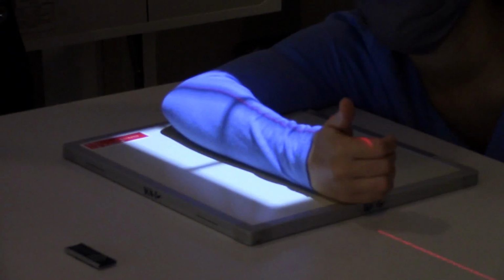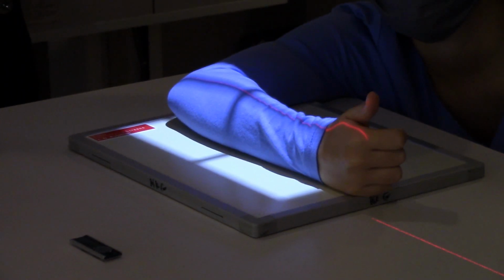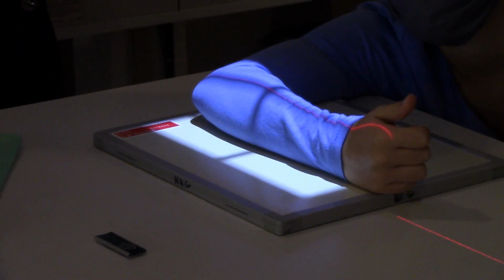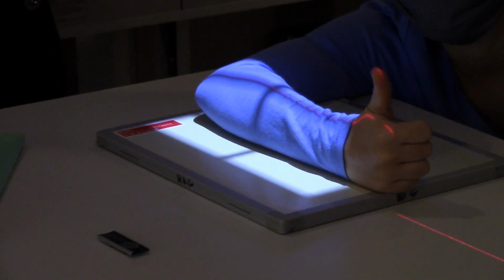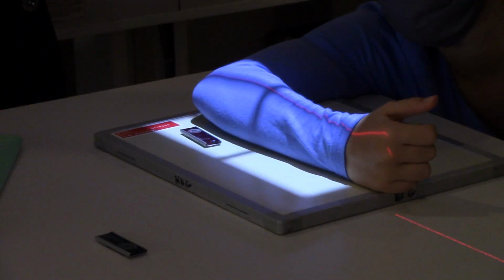Okay, now our humerus is basically on plane. Cool, what do you think? All right, we got a thumbs up from the patient. Does it matter that this is at an angle? That's supposed to be at an angle.